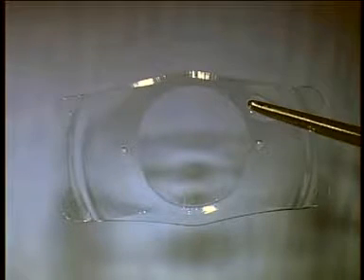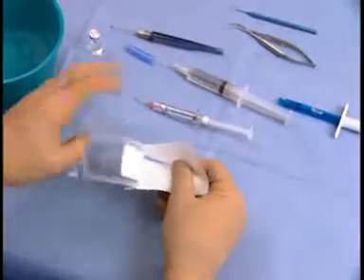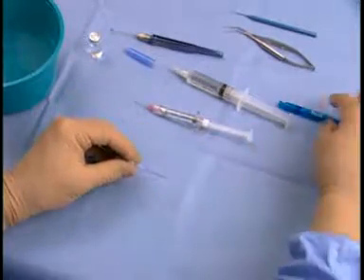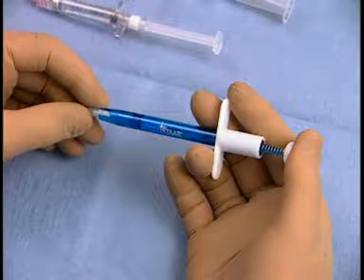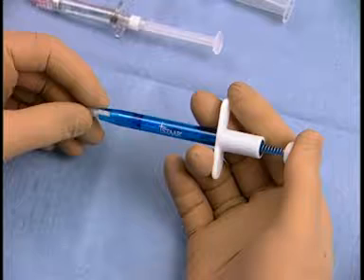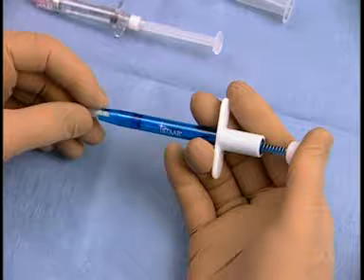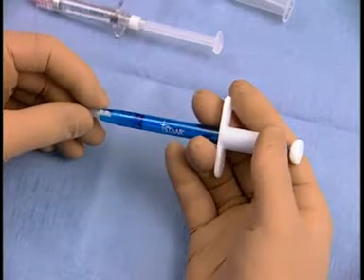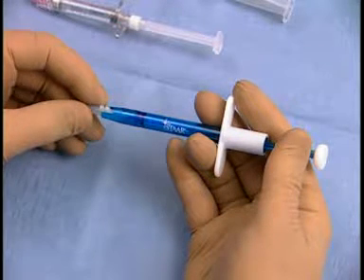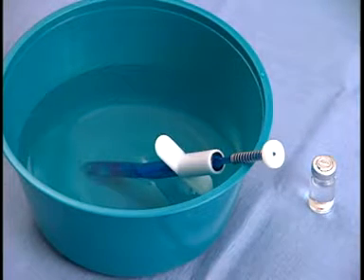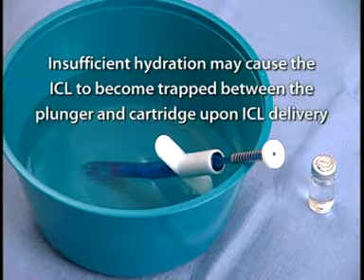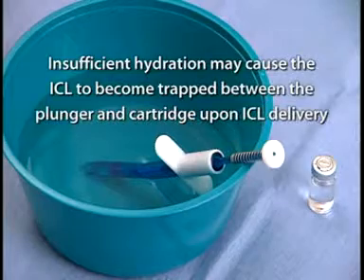The STAAR ICL is made from Collamer, a hydrophilic collagen copolymer. To begin, remove the foam-tipped plunger and holder from the package and insert it into the injector, base first. The vertical tab of the holder is not intended to be snap-locked into the notch of the injector. Advance the injector cap until the ball end of the plunger interlocks with the injector — a click can be felt and heard when the plunger is properly secured. Retract the injector plunger fully and remove the holder. Place the assembled foam-tipped plunger and injector into BSS, ensuring the tip is completely submerged. Hydration of the foam-tipped plunger is extremely important, as insufficient hydration may cause the ICL to become trapped between the plunger and cartridge upon ICL delivery.